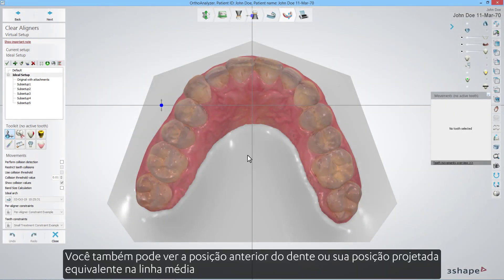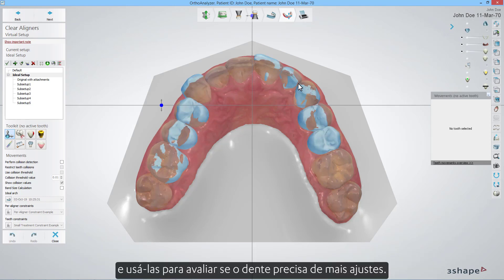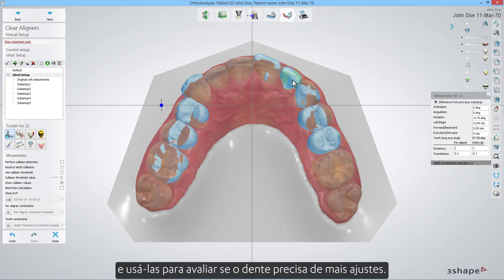You can also see the tooth's previous position, or its counterpart projected position across the midline, and use those to evaluate if the tooth needs further adjustments.